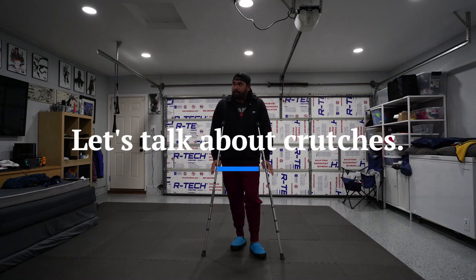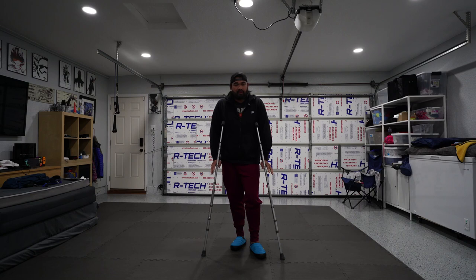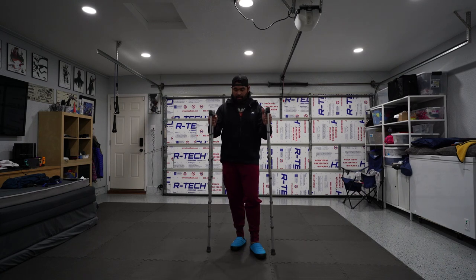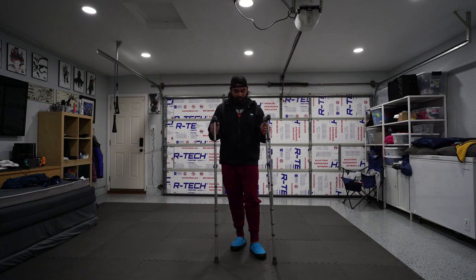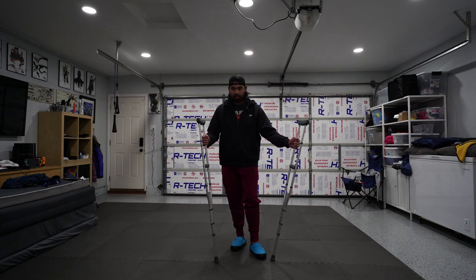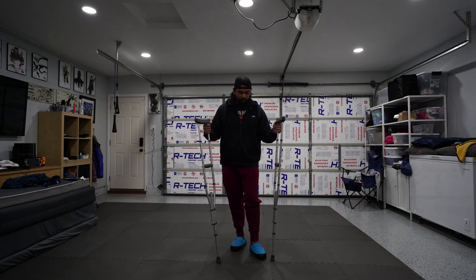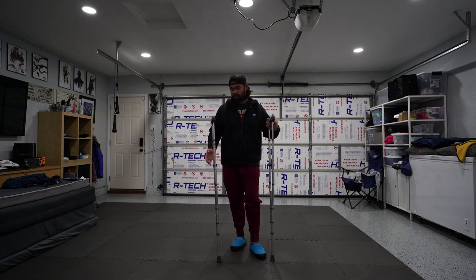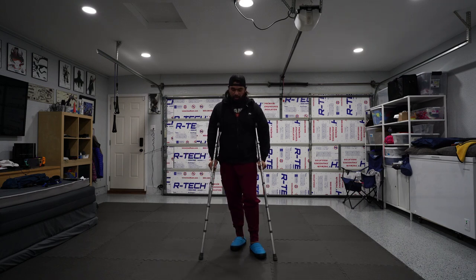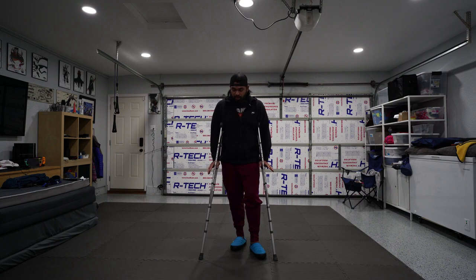Some of the things you have to learn when you have a leg injury is how to use devices. Today I just have crutches. There are several ways you can use them. Some people just use one crutch — I'm using two. It gives me more support. It heavily relies on your upper body for mobility and stability.